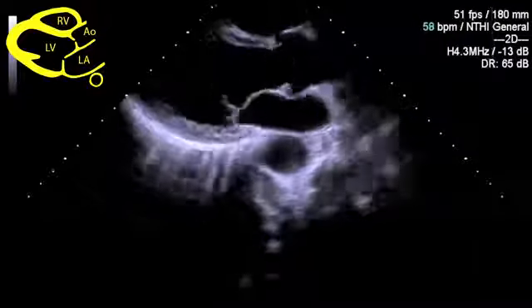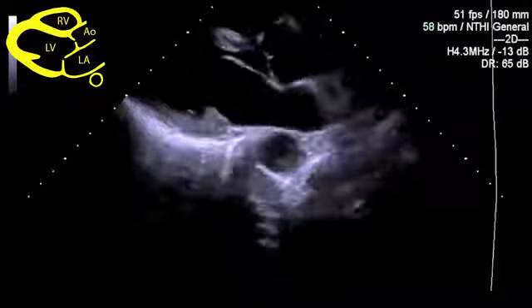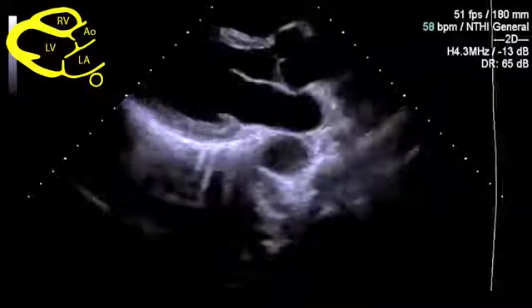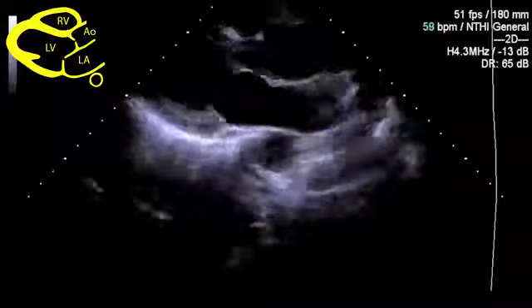Have a look at the pericardium, which lies behind the heart, in front of the descending aorta, but behind the infralateral wall of the left ventricle. A pericardial effusion will be seen in this position. Anything distal to the descending aorta is likely to be a pleural effusion.